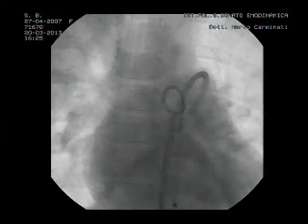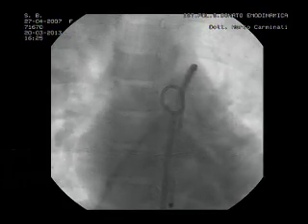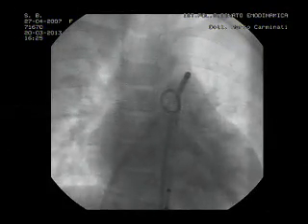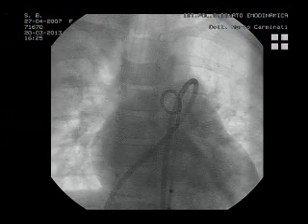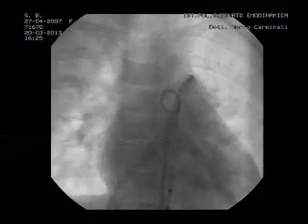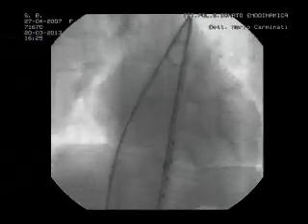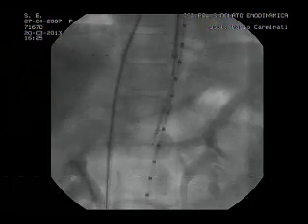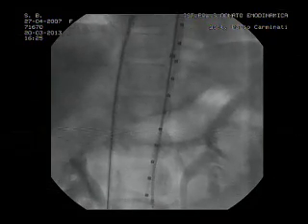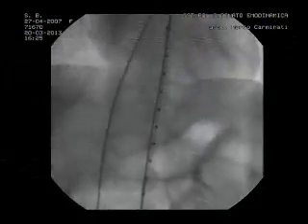Joachim? Mario, this is Joachim. Hi, Joachim. I think, honestly, part of the problem with your first device, maybe you didn't pull it enough. I don't think it was well expanded, the pulmonary end of your device. So whatever you do now, I think 8.6 is a good choice. But I remind you to do an angio on the RAO view, just to be sure that the device is not simply squeezed inside the pulmonary end of the ductus, which I think was the case partly with the first device. Yeah, maybe, but so you'll need to pull. I think you'll need to pull a little stronger on your disc, so you push it, you wedge it much better inside the minimal diameter of your ductus.